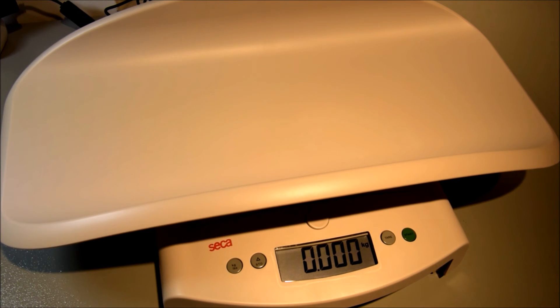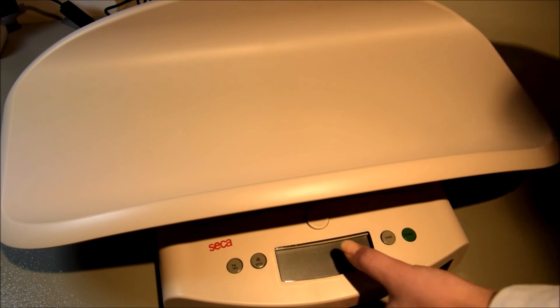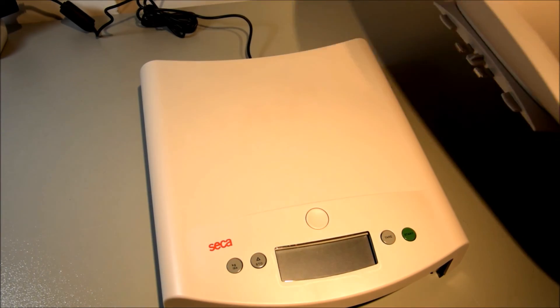The Seca 354M can also be used as a floor scale for small children by pressing the button in the middle, which unfastens the tray from the base.